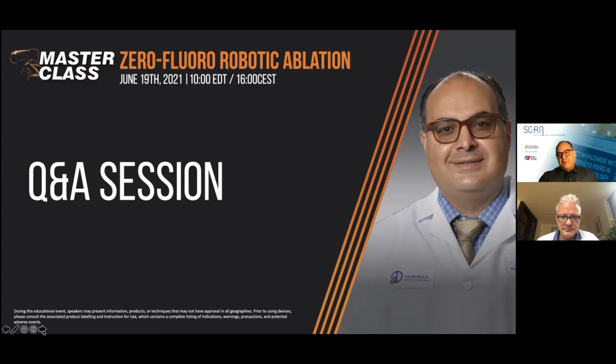So my approach is, I know this may be controversial, but I want the patient to be comfortable. So I start with MAC to gain access, and I do a full EP study to see if the arrhythmia is inducible or not. If the patient is not inducible, then I will stop the propofol and wake the patient up. It's much easier for the patient because they didn't have to suffer through access and those sorts of things. So they were comfortable, the catheters are in, and then I try to reinduce it.